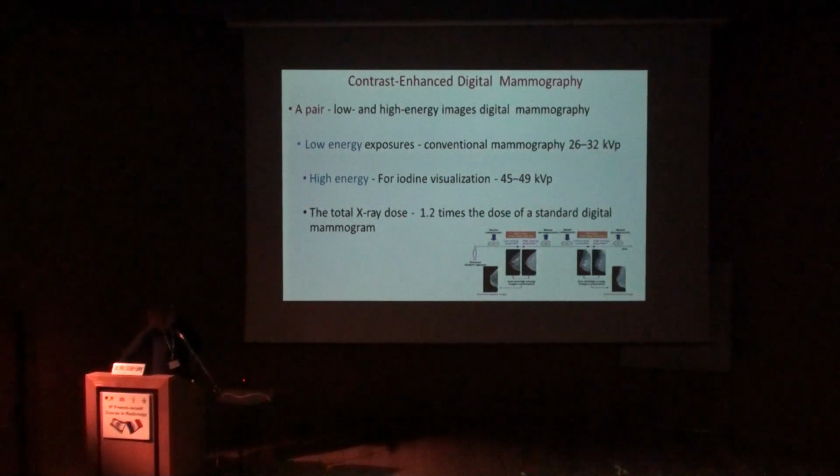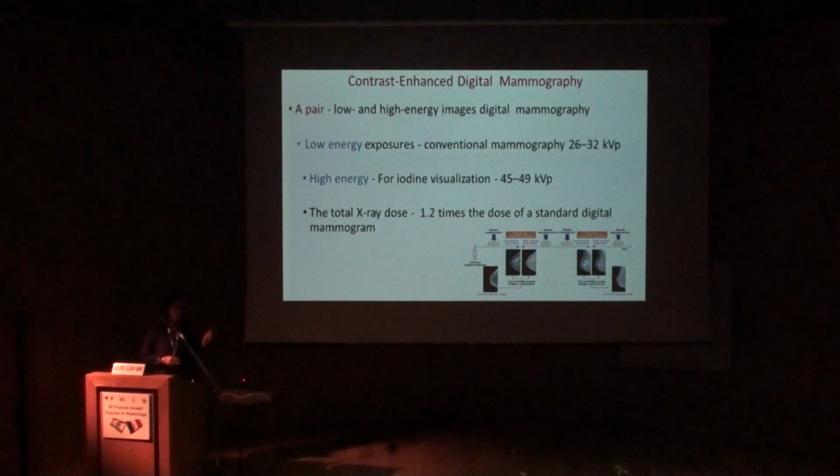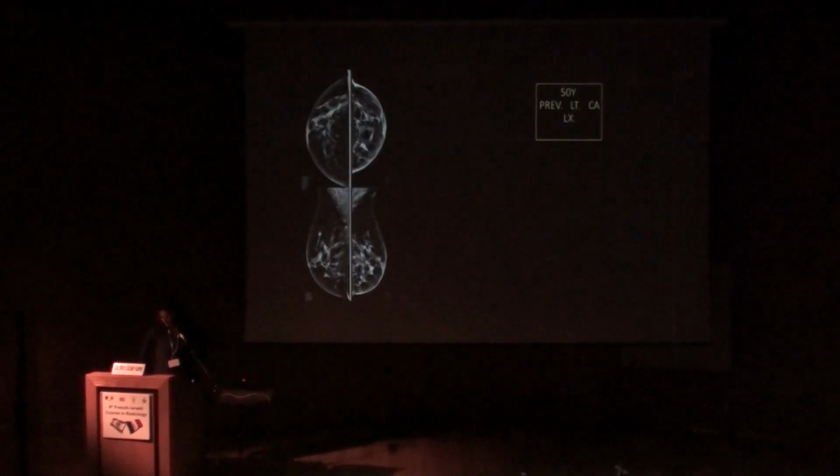We start to image 2 minutes after the injection, and there is always the issue of the radiation, so the radiation is 20% above. However, from our daily practice, unless we had the contrast mammo, we will add spot, lateral, many views which are comparable to the addition of this 20% of radiation. So it spares us the additional views that we are using when we are doing only digital mammography.